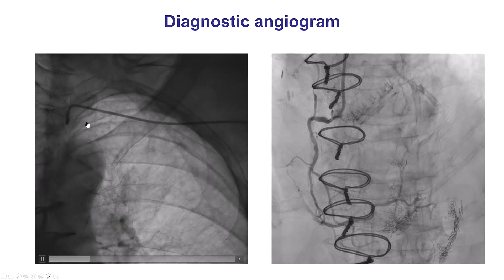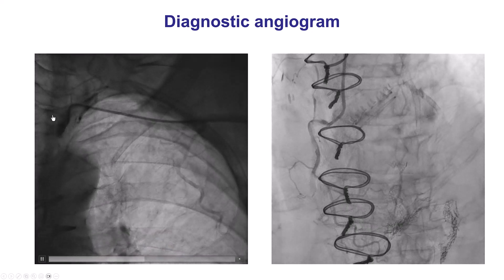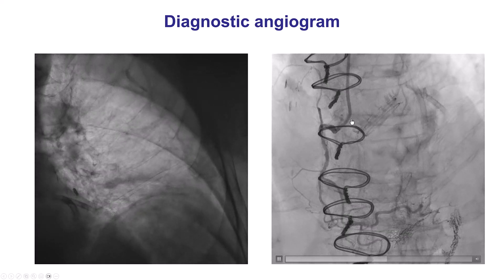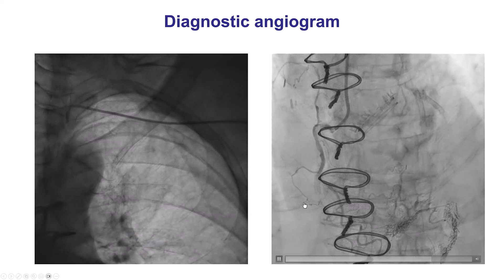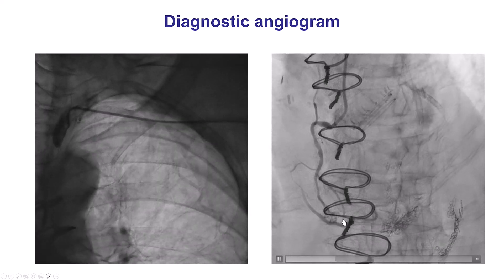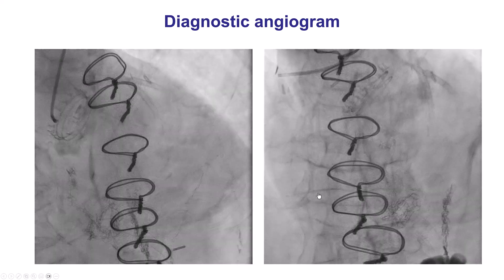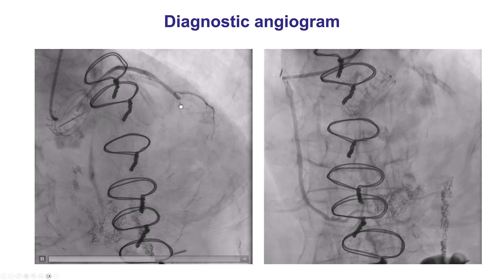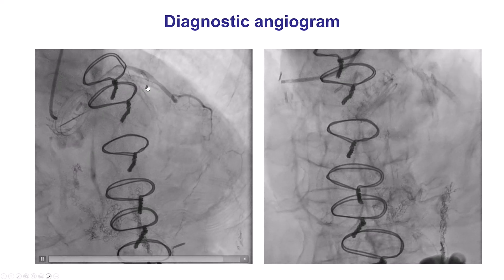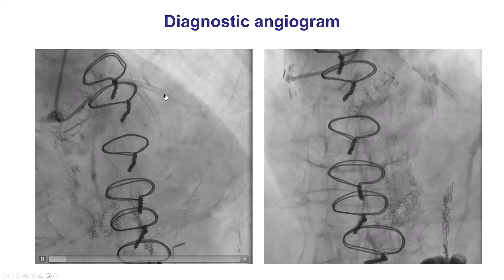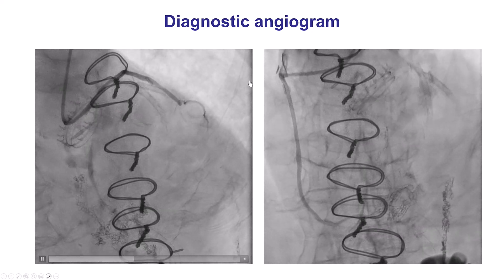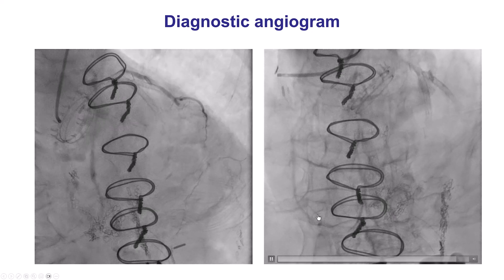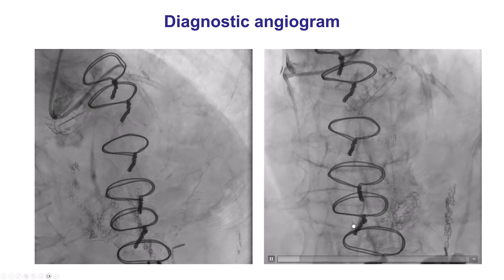This is a coronary angiogram showing occlusion of the LIMA to the LAD. The native RCA has diffuse disease and multiple previous stents. There is a patent bypass going to the diagonal branch, that is distal to a stent in this diagonal branch. And there is also a patent radial graft going to the distal right coronary artery.